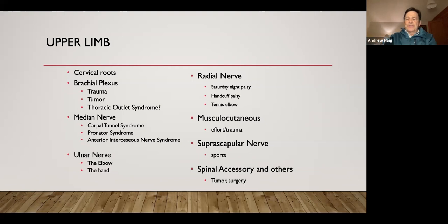Going the other direction, you've got your six shooter, which is your thumb and your index finger. You go up towards the arm, you get C5, way up in the shoulder, above the elbow, and above the shoulder is C4, right? So the complaint can tell you a lot too, but on the EMG especially, you're going to look for two different muscles from two different nerves, but the same nerve root. That, and in the lumbar region, especially the paraspinals, okay? The brachial plexus, well, the paraspinals are normal, duh. But again, you're going to be looking at, is it just one nerve or is it two different nerves that are part of the anatomy? And we're going to come back to the anatomy in a minute to whet your appetite, right?